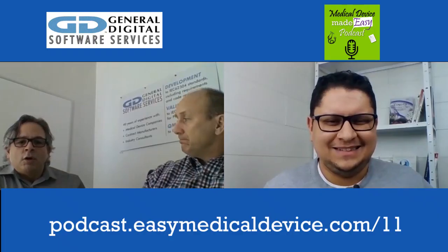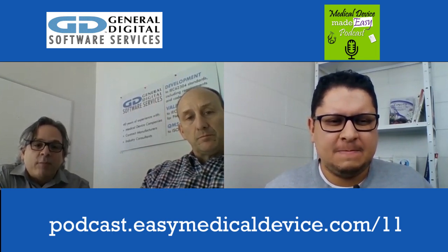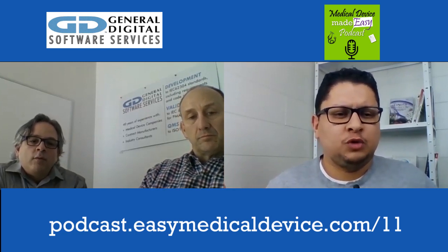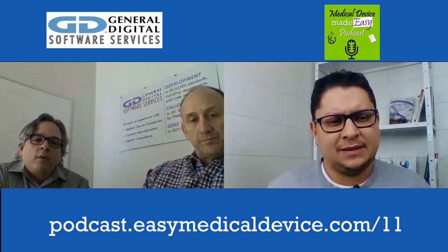Okay, good. So let's dig into the technical part then. Sure. Well, on the V&V aspect, you want to start that process extremely early in the development process. The further you wait, the more costly it becomes. So on the procedure that we are creating, in the planning phase, it should already be discussed and planned, and not wait until we are moving forward on the creation of the product or the software and then think, oh, we forgot to do this. So as you mentioned, something we should really plan early in our process.